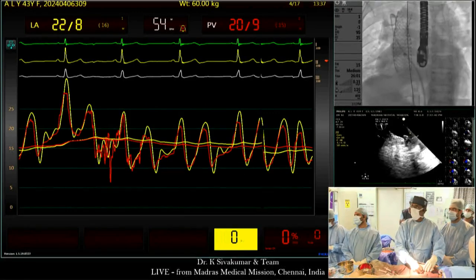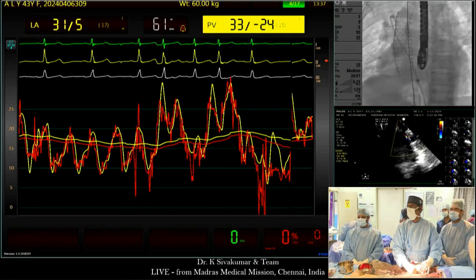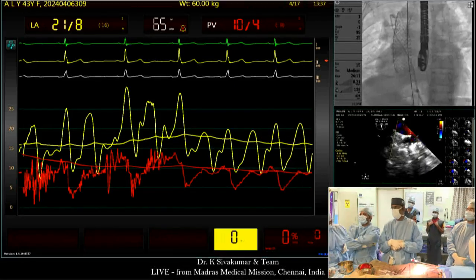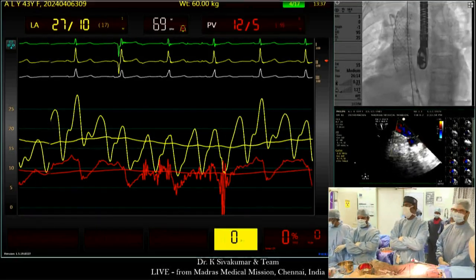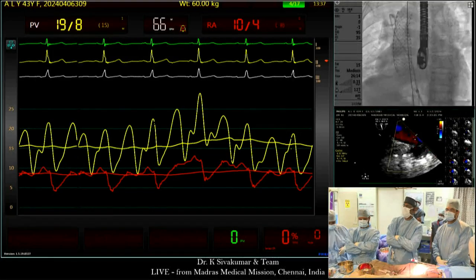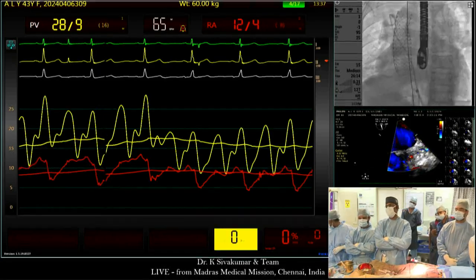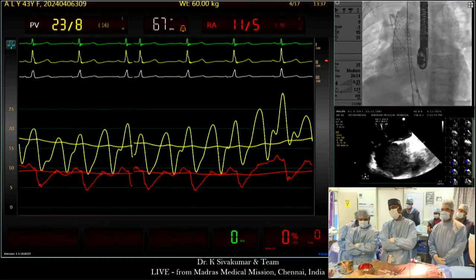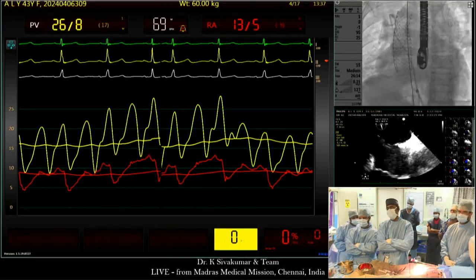We have a question from Gregor. Go ahead. I belong to the center which would do this surgically, honestly, and I'm looking forward to learning more on Friday. Having said this, in these more than 300 cases which you mentioned earlier, is there any sinus nodal problem? Is there any thrombus problem? And what we now discussed, diaphragm, are there patients with phrenic paralysis? Could you comment? Gregor, a great question. Actually, we have done about 135 till now, and we did not have a single incidence of sinus nodal problem. But in the world literature, when Eric Rosenthal collected all the data, there was one patient who developed significant sinus bradycardia and subsequently needed an atrial pacemaker.